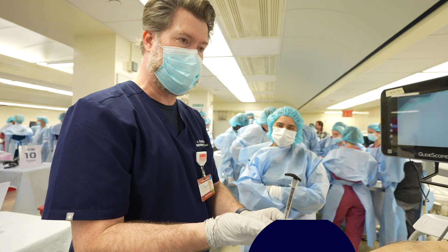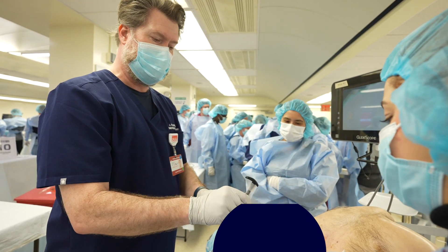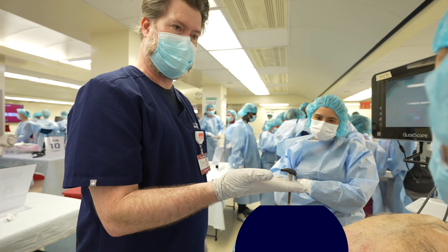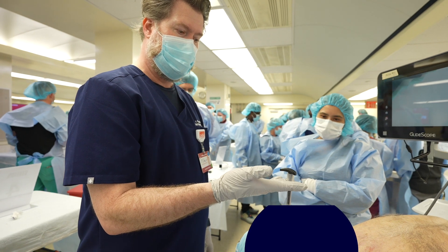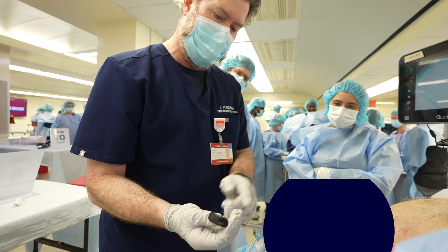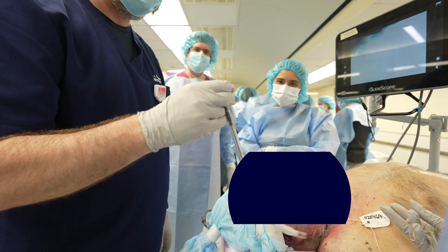I'm going to show you a very simple technique to make it a lot faster. Instead of holding it the usual way, you're going to hold the palm up and put it in between your fingers like that, then put your thumb underneath. Now you have two fingers behind and two fingers up here.